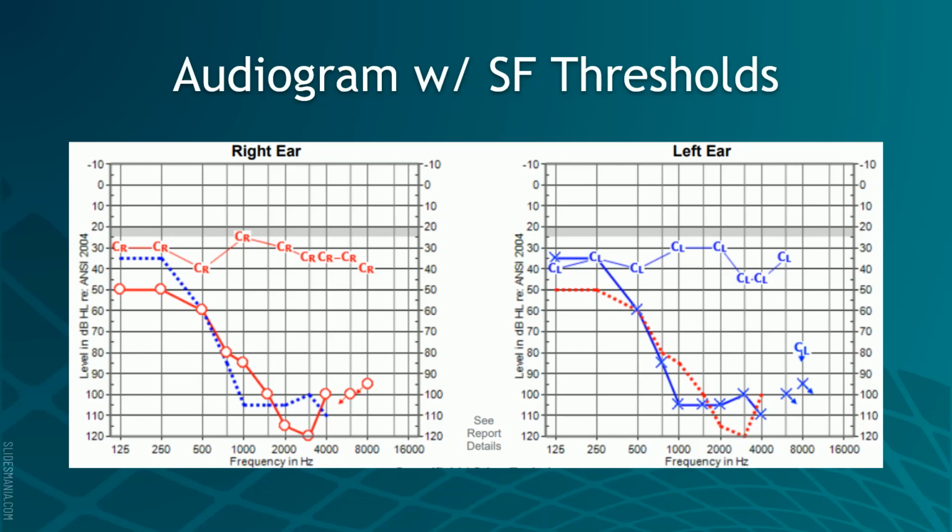So now you're sort of reset on where this fits in the general timeline. Once we saw this, we saw the residual hearing, we saw the sound field thresholds. We kind of liked where our T levels were. This was a great starting point. It definitely should have given the patient some more audibility.